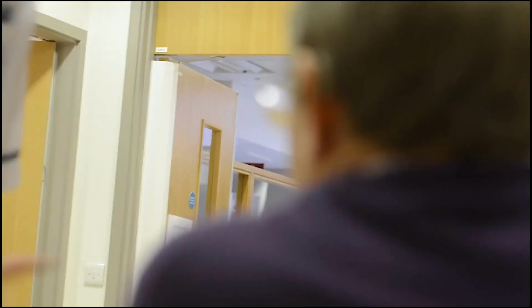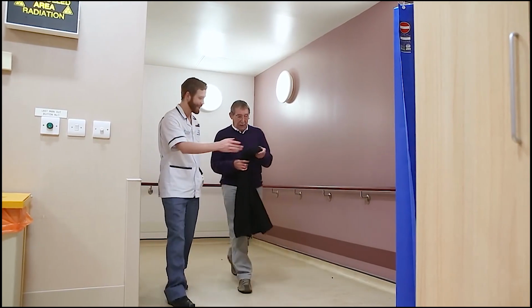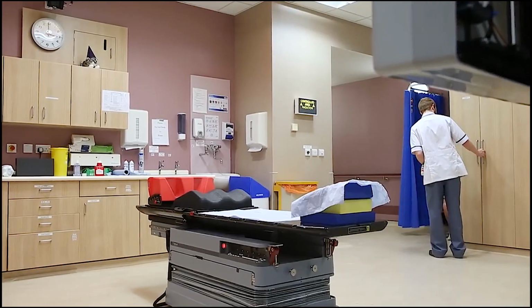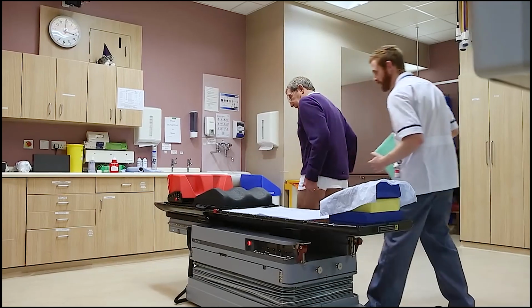As you are entering into the treatment room, we will be asking you to confirm your name and date of birth. This is because we want to make sure that we are taking the right patient through, and also we want to verify we are holding the right paperwork in our hand. We ask you to remove your shoes and your trousers. You're absolutely fine to wear anything on your top. We ask you to leave your underpants on. If you are wearing a metal buckle, we can't see the fiducial marker where we want to focus on. That's the reason we don't want any metal part in that region.